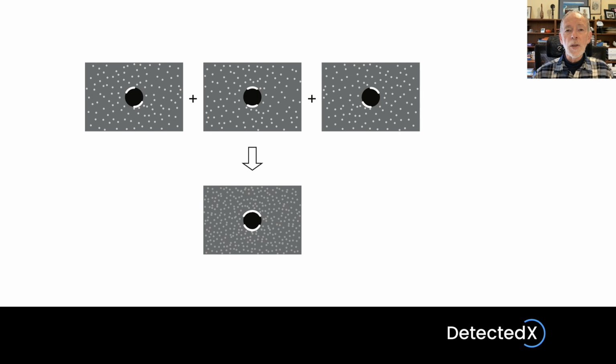Notice also that the part of the cyst wall that is imaged is going to be different in each image because the beam direction is different. And so when we combine those images together, we get a more complete display of the walls of that cyst. So these are the 2 primary things that compound imaging wins us: finer and less pronounced speckle, and also more complete display of tissue boundaries.